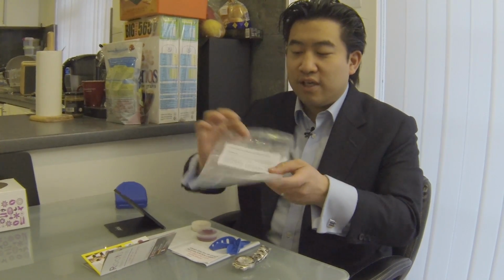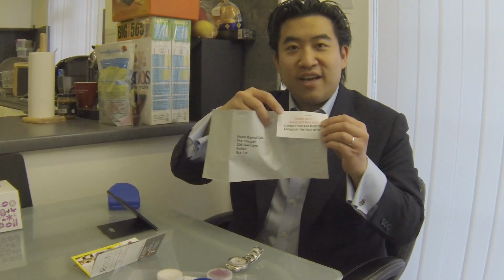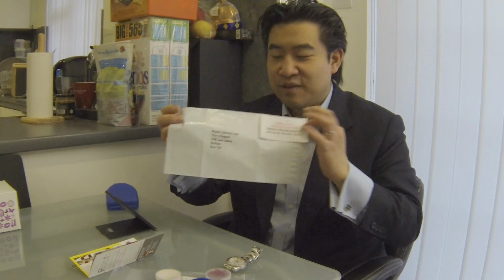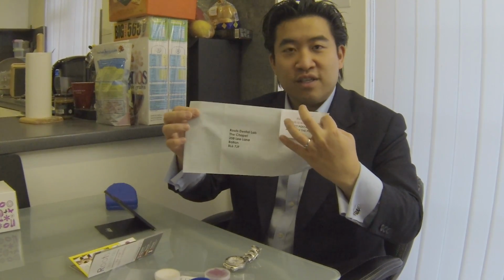Let it cool down or warm up, or whatever you want to call it, solidify for 5 more minutes after that, and then you stick it in one of these bags. So you fill out all your details, your phone number, your first name and your surname, and then you send it in this not free post envelope. They do put that down on here. I'm not quite sure why they don't bother paying for the postage, because you do pay quite a lot of money for this in the first place, but they don't, and it gets sent off to this address.